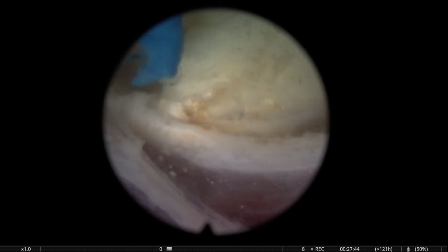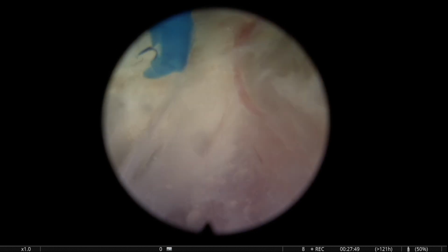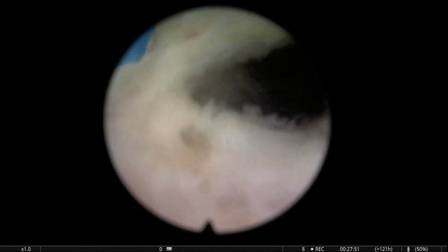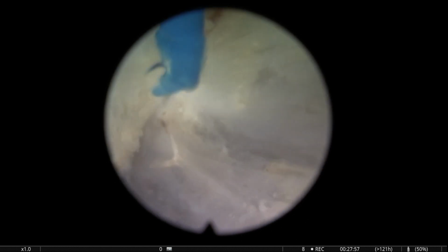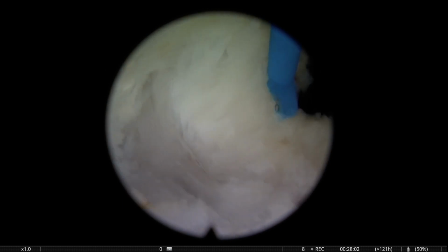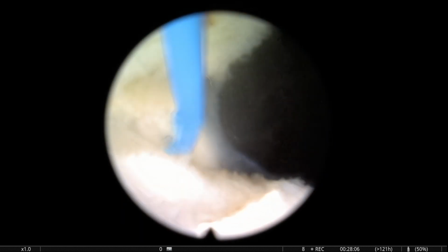But of course, if you are able to work continuously, or let's say work most of the time, if you don't hesitate too much, then you can progress very fast and try to complete these operations. Often at the end, we are going to see that we are nearly undermining the bladder neck.